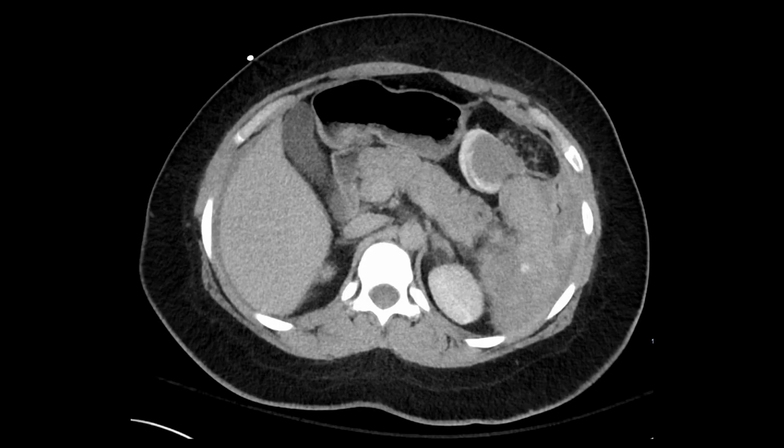This is another case. So we have our liver here and a very unhappy spleen on this side. So here is the area which is most abnormal, and we have some free fluid around the liver too, but we can ignore that for this moment.